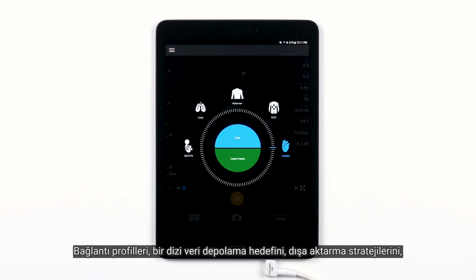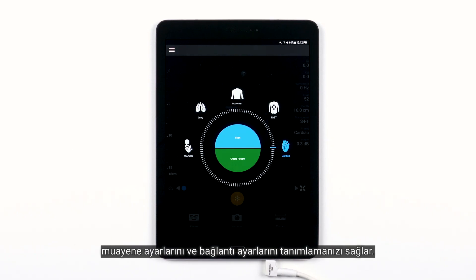Connectivity profiles let you define a set of storage destinations, export strategies, exam settings, and connection settings.